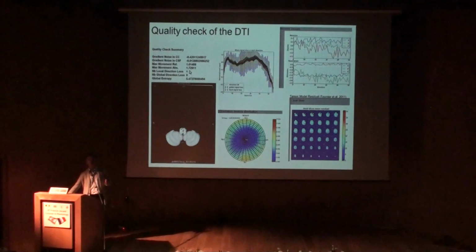When the direction doesn't reach the quality threshold, it is automatically removed from the analysis. So it tells you here that one direction had artifact, whether it be motion artifact or other, so it's automatically suppressed from the analysis, and you get this kind of other quality assurance check.